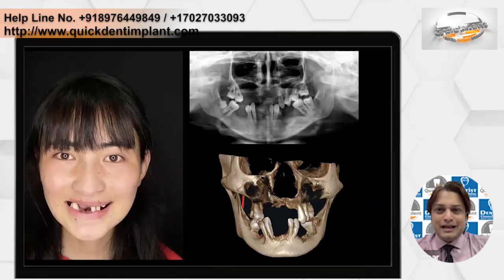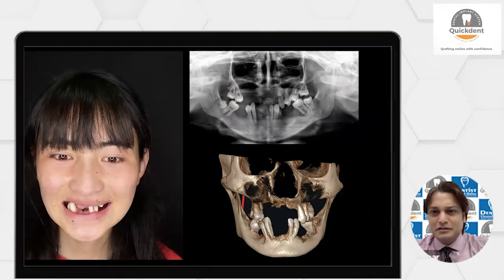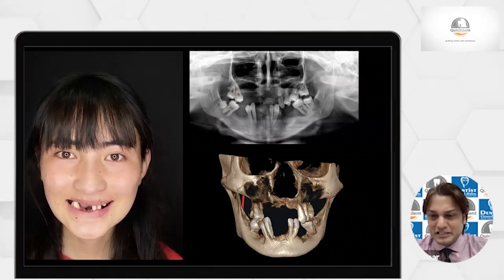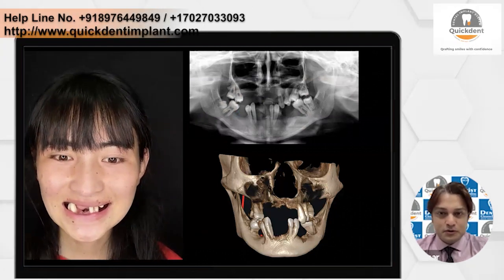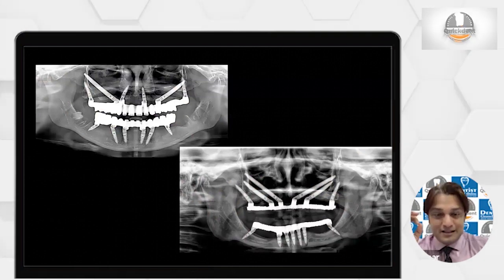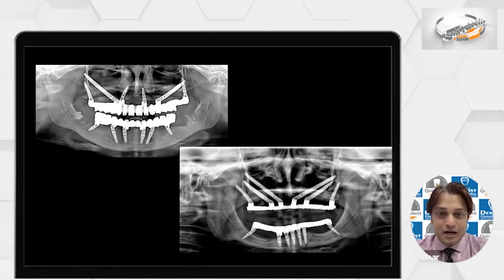Suppose a patient comes to you like this. You can see the x-rays, see the confidence and energy level, see our x-rays. She has totally atrophied bone, there is a lot of bone deficiency. It's not easy to restore such a case. However good a surgery you do, any heroic surgery, you do zygoma, you do quad zygoma, you do nerve bypass, whatever you do, what is the patient more interested in? The patient is more interested in the final outcome. Am I right? Are you getting it?